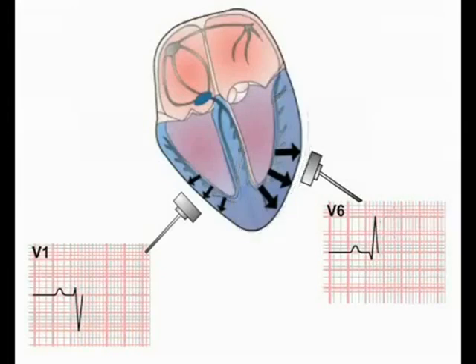The flow of depolarizing current around the ventricles is recorded as the QRS complex, and as we've just seen, the morphology of the QRS complex differs predictably in the ECG leads depending on their position relative to the heart. We'll come back to the precise nomenclature of the QRS complex later. When ventricular depolarization is complete, there is a brief period when no current is flowing and the recording returns to the isoelectric line. This period ends with the onset of ventricular repolarization.